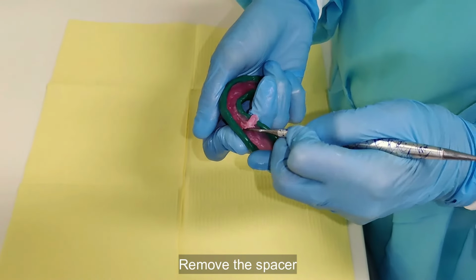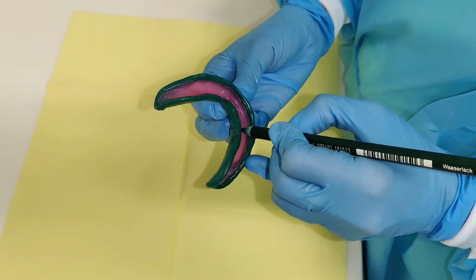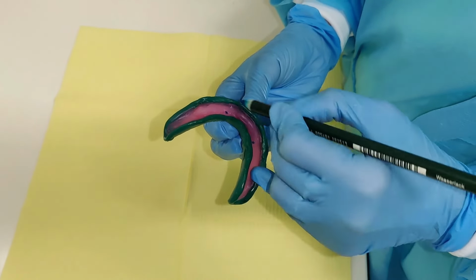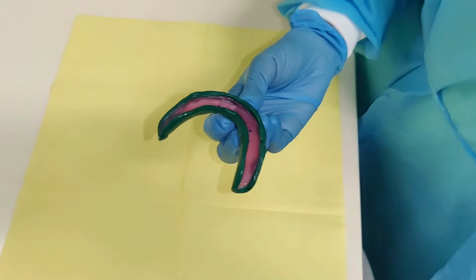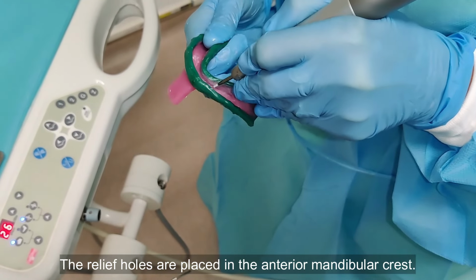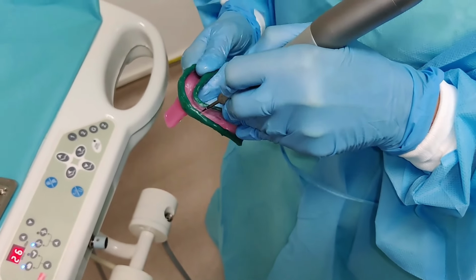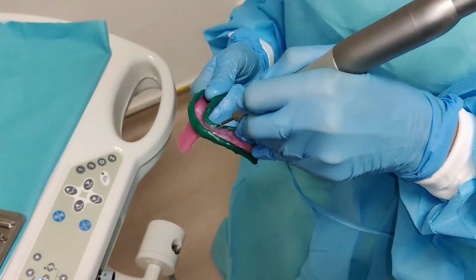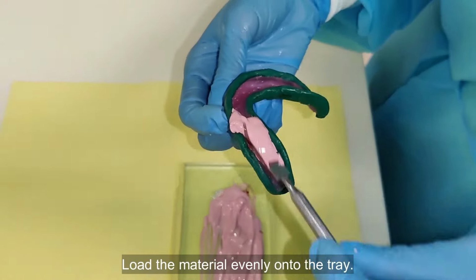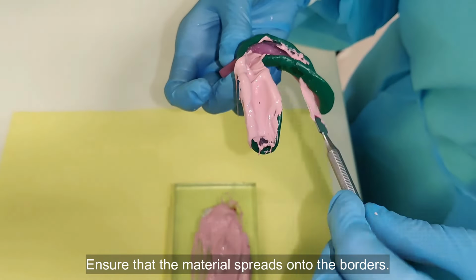Remove the spacer and place relief holes prior to proceeding with the impression. The relief holes are placed in the anterior mandibular crest, load the material evenly onto the tray. Ensure that the material spreads onto the borders.